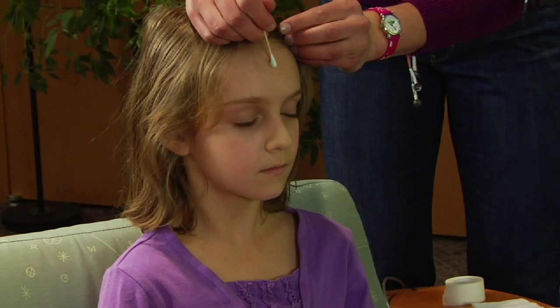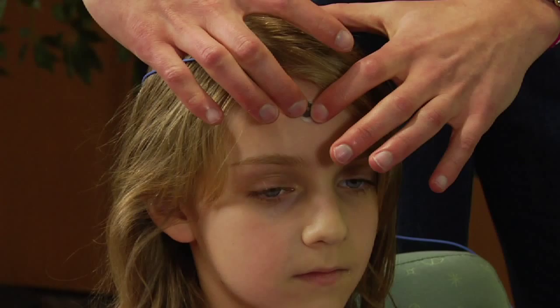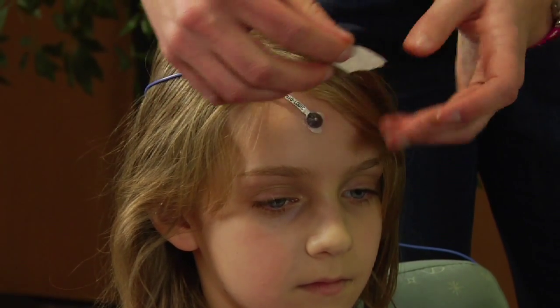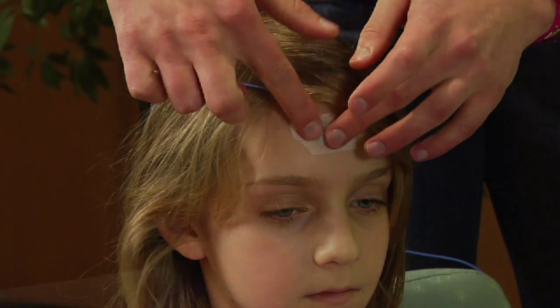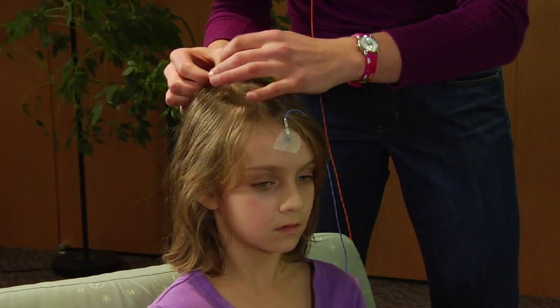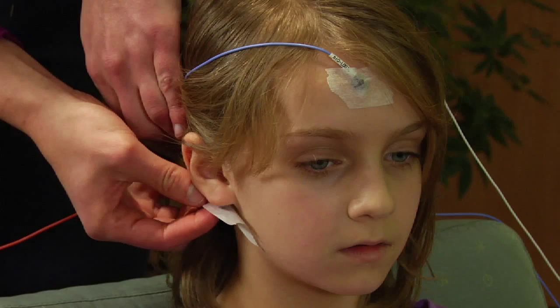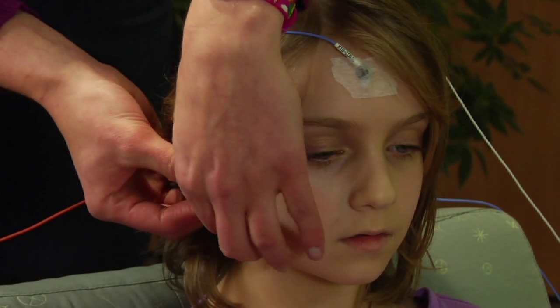After cleansing and preparing the skin, three electrodes are placed on the person's head. The ground electrode can either be placed on the forehead or on the left earlobe. Today we will be using the forehead. One electrode is placed on the top of the head at CZ and will serve as the active channel. The reference electrode is placed behind the right earlobe.